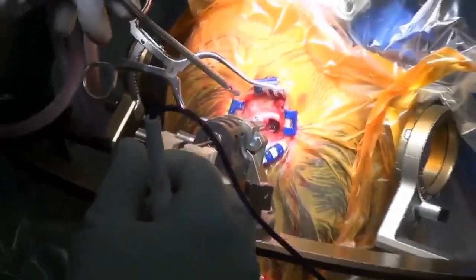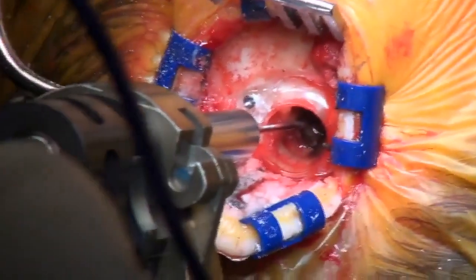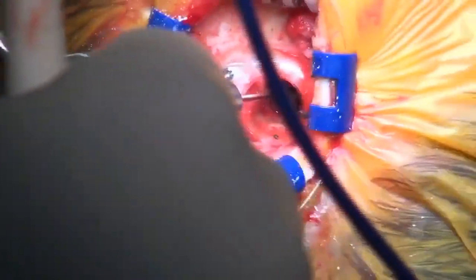So that's our little sharp tip stylet. Now we'll use our cannula through which the DBS electrode will be placed. That's good. I don't see any deflection there, so I'm happy with that. And this is kind of that moment in the operation that everything goes to slow motion.